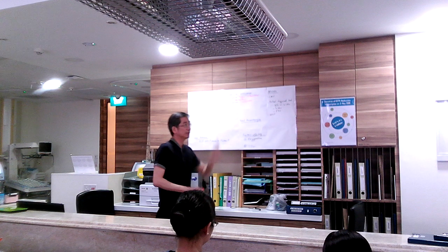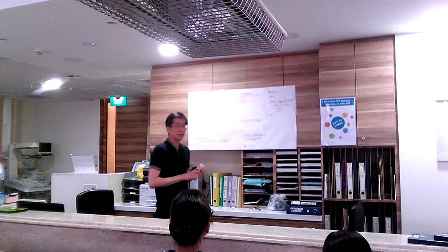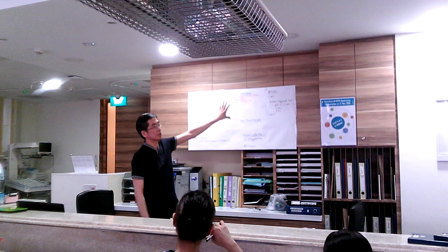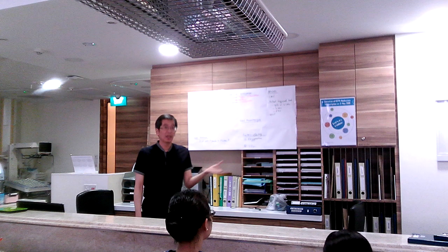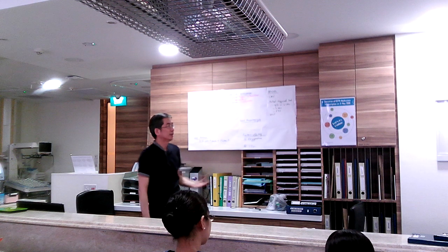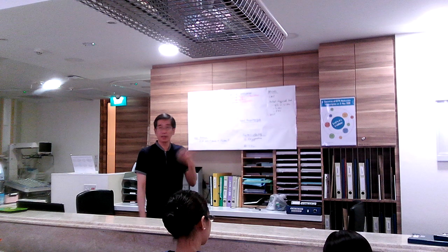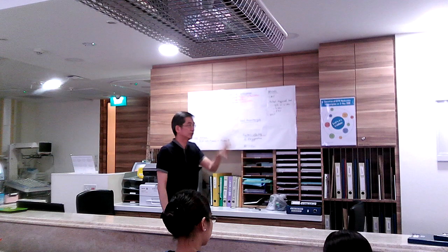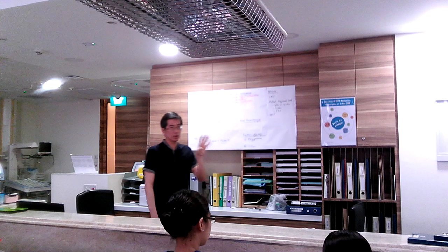Okay, so that's something that most of the time we don't quite use anymore, but we still consider using it in patients that are very severely sedated or paralyzed. Where there's actually not much need for feedback and the baby is not breathing much, then we use this mode because it allows us to give a very steady, very definite breath, which is under our control.